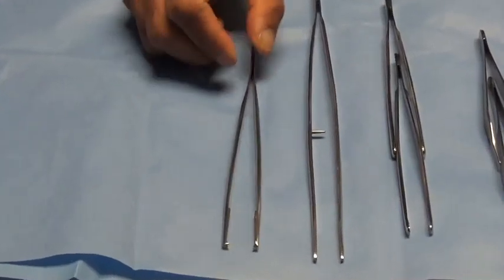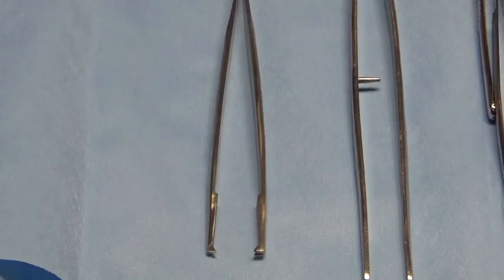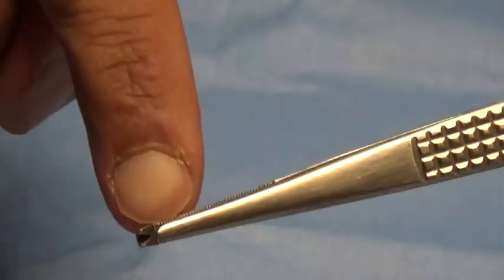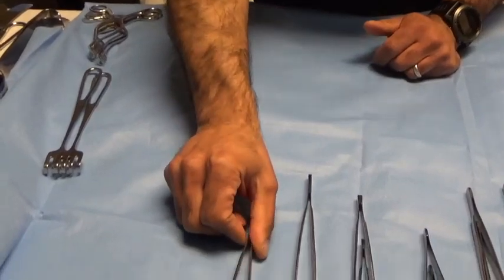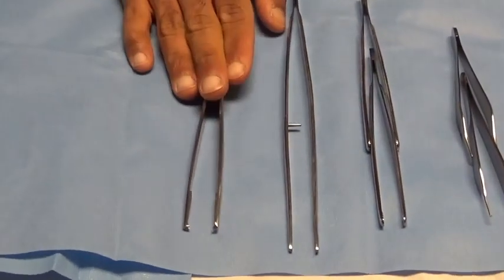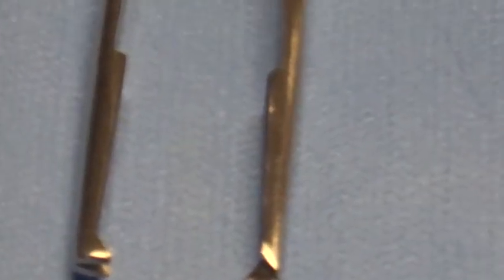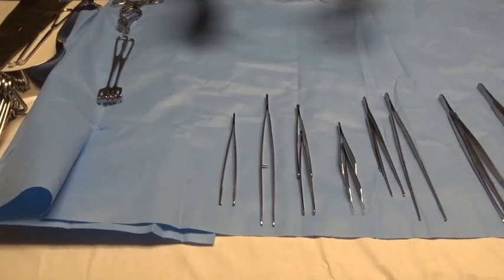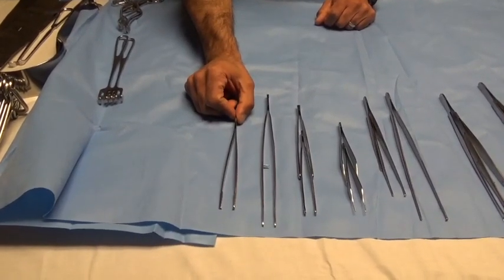Our last forceps in the set is a Bonney's forcep — also unpaired like the packing forceps — utilized pretty much exclusively for fascial closure. Notice it has very pronounced rat tooth formation on the end, and also a non-crushing aspect just below the teeth, designed to allow you to grip and grasp the fascia as you're effecting fascial closure or any deep layered closure requiring a good grip on the tissue. It's unpaired because that instrument generally works by itself. There are variations on this instrument — the eponym at our facility is a Bonney's forcep, but it may also go by the eponym Ferris-Smith, which historically has a rounded handle giving you a broader gripping surface.